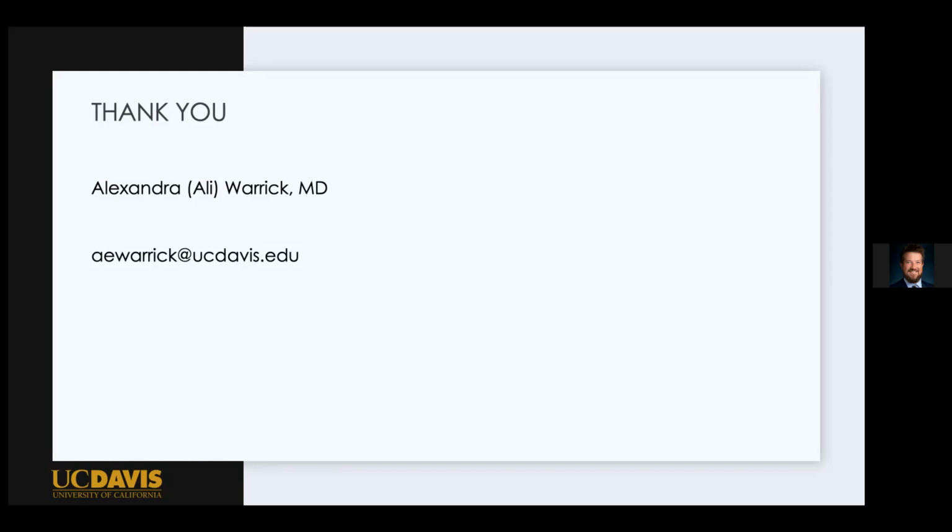At least for me personally, it was not helpful, and it's probably just because I'm not smart enough to figure out when I'm supposed to zig and when I'm supposed to zag and which part of the Z am I on. And so it was never helpful for me. I think just knowing your anatomy, where a structure comes from and where it goes to can be really helpful. But the Z technique certainly can provide at least some sort of guidance for the lateral knee.